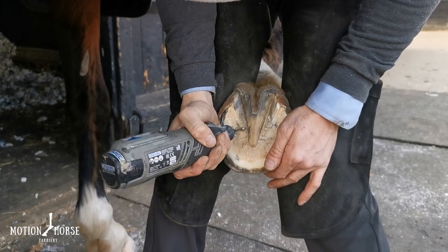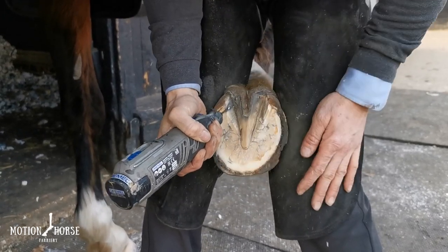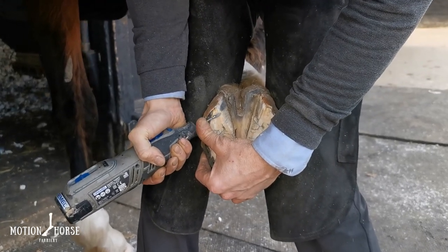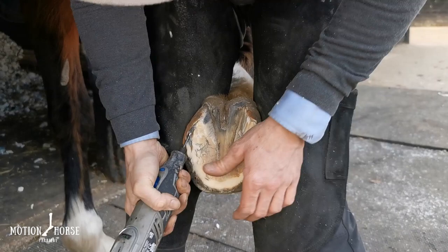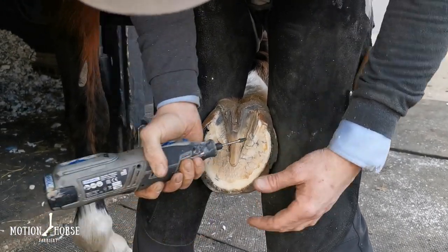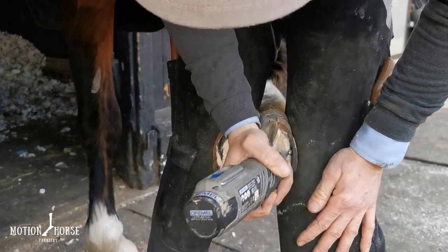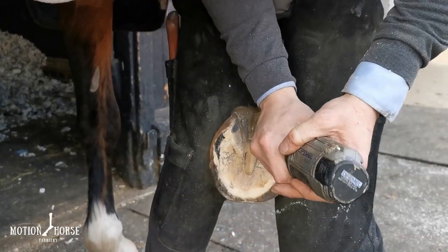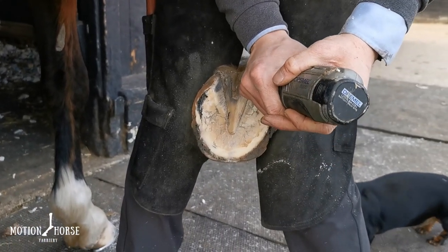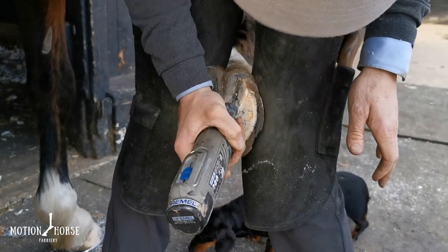Good clean out. The material is going to cover the majority of the sole — it probably won't cover the top of the frog, but it will cover the majority of it, so I want to make sure it's as clean as possible. The Dremel is great for getting into the seat of corn area for a good clean out, and also down the side of the bars to get all that dirt out.